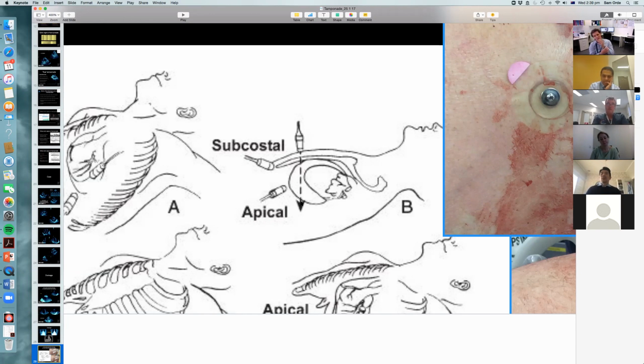As long as you're good with the echo and you're using it to line yourself up absolutely perfectly, I use a mark and then stick the needle in approach rather than going real time, but you can do both. You can give yourself a bigger landing zone by going off axis.